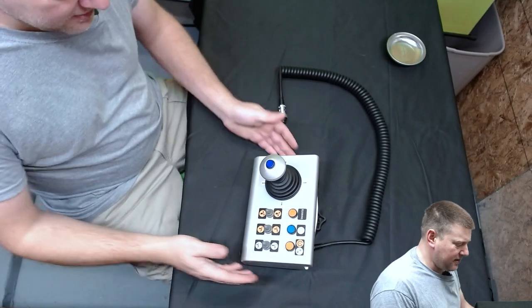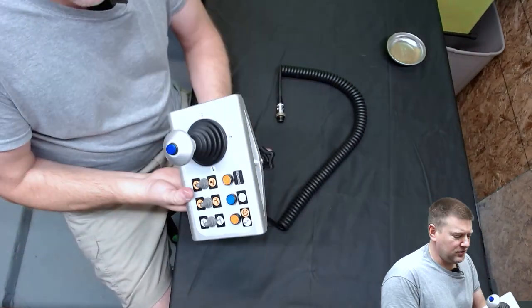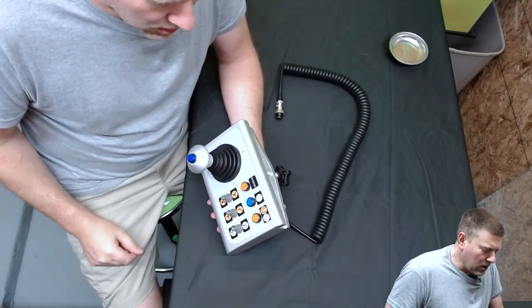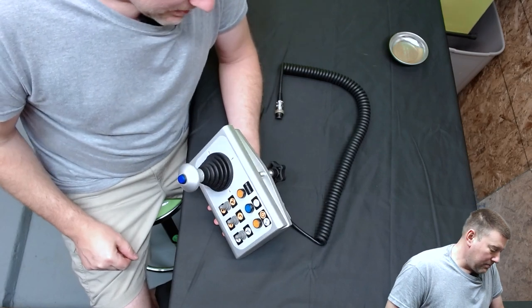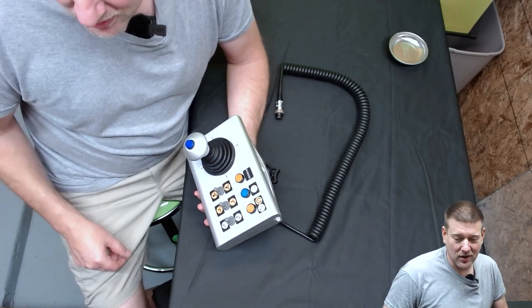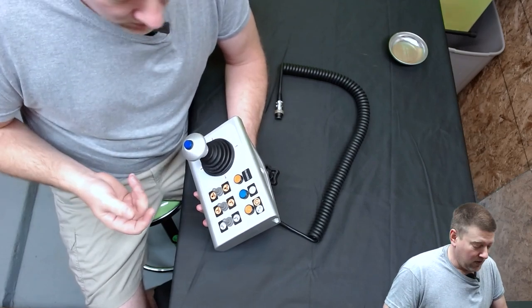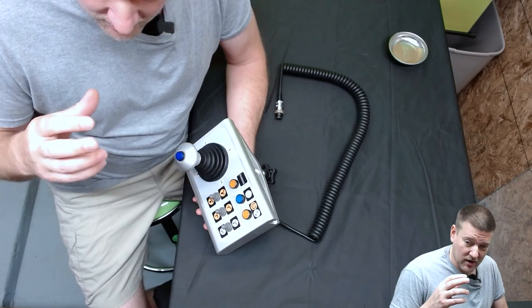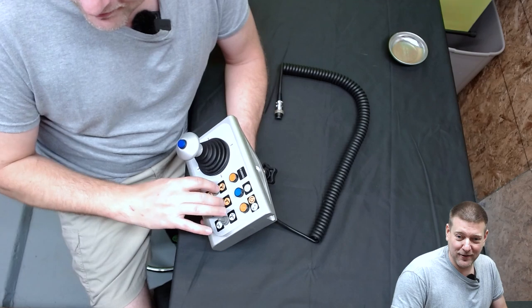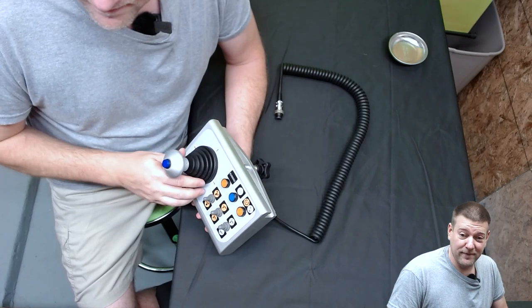Here we have our hand control for a DRE C-arm table — very similar to the table I did a repair video on a few days ago. One thing I have to tell you is that this is a beefy hand control. It does have a couple of weak links, but when it comes to overall quality, it appears they spared no expense. This guy is an absolute beast.